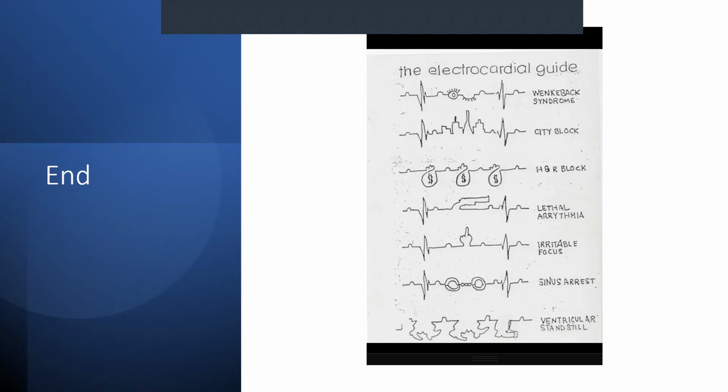We have to have a whole tutorial on that because there's a whole way to do it. But basically, you have to put the machine in pacing mode. You have to place your pads. You have to get electrical capture, physical capture. There's a whole way to do it. We'll try and do it one of the days, hopefully. We'll have like a practical tutorial on it. But good question.